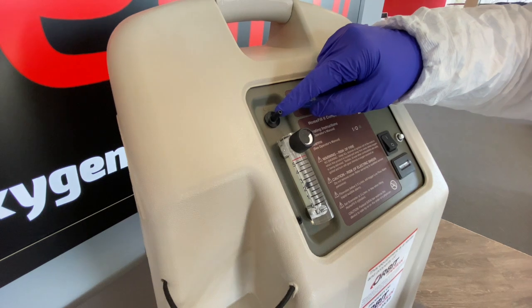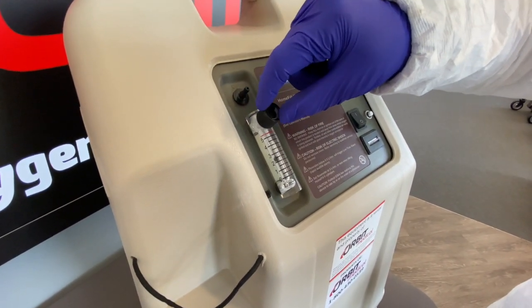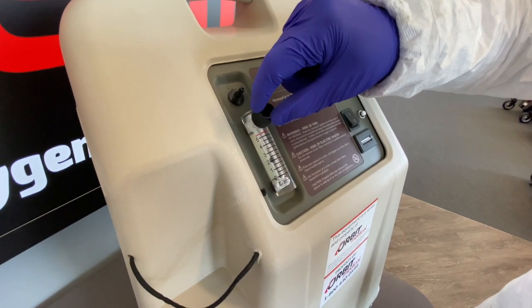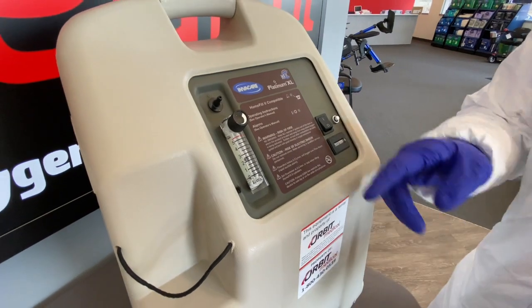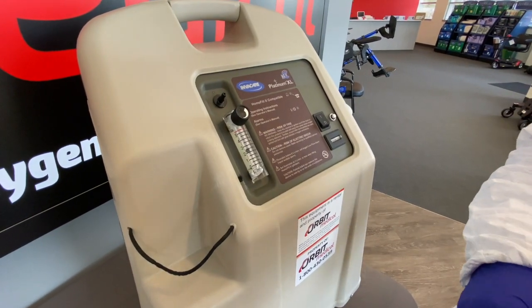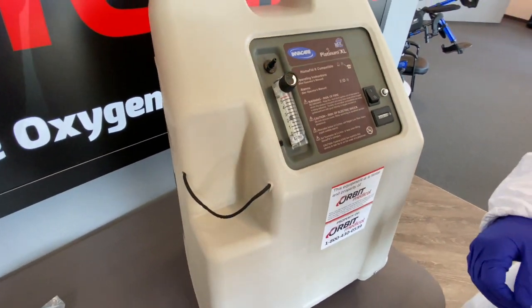To the left of the machine here we have the connector where you're going to connect your tubing. This is going to be your dial — this is what you're going to be turning to your prescribed liter flow. Most of our patients are at two liters per minute, so as you can see I've set it to two liters per minute.